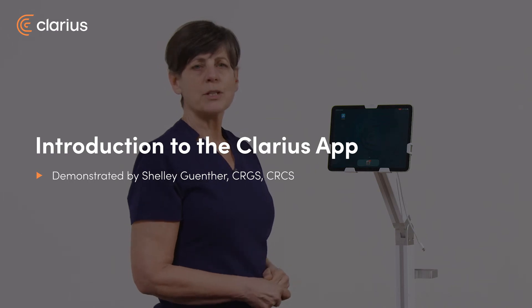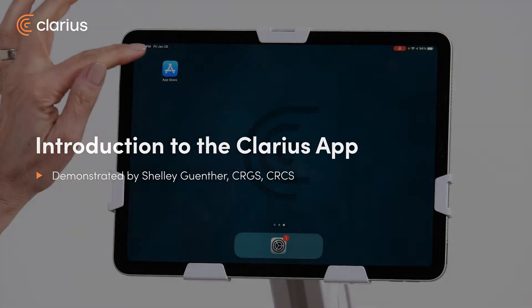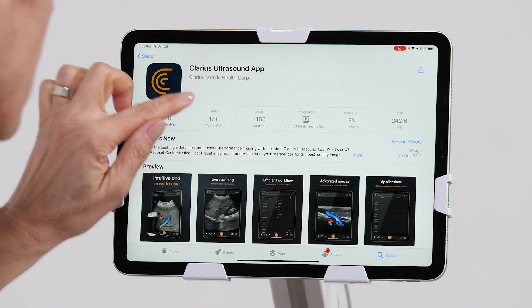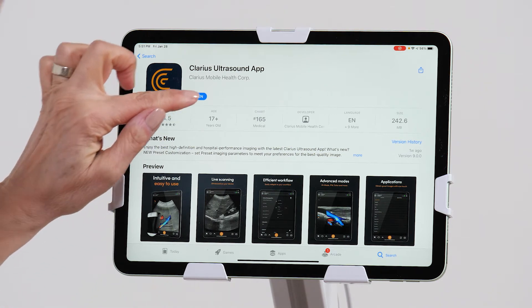Hi, my name is Shelley, and today I'm going to show you how to get started with your Clarius scanner. First of all, you're going to go to the App Store on your device and locate the Clarius Ultrasound app. You're going to download the app, and now we'll open the app.